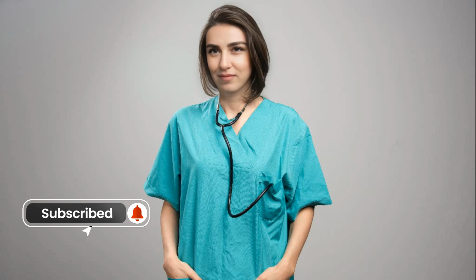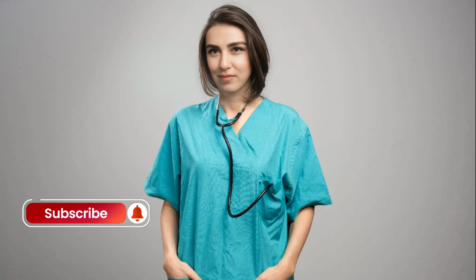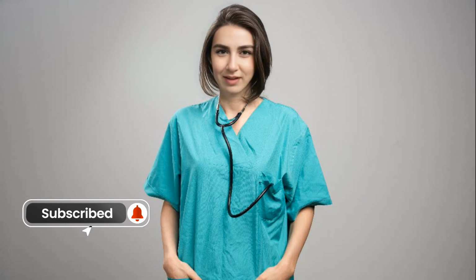2. Immediate symptom relief. Angioplasty can quickly restore blood flow, providing immediate relief from symptoms like chest pain and shortness of breath. 3. Emergency treatment for heart attacks. Angioplasty is the preferred emergency treatment for heart attacks, especially if performed quickly. It can open the blocked artery responsible for the heart attack and restore blood flow, minimizing heart muscle damage.